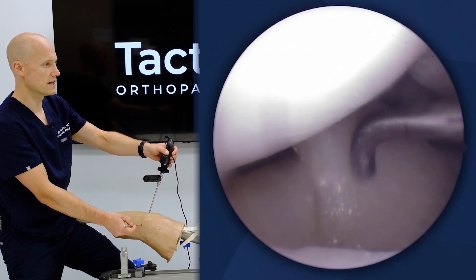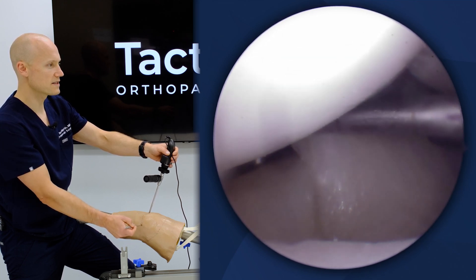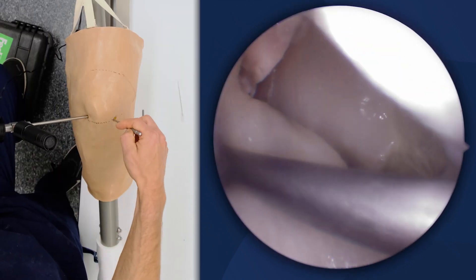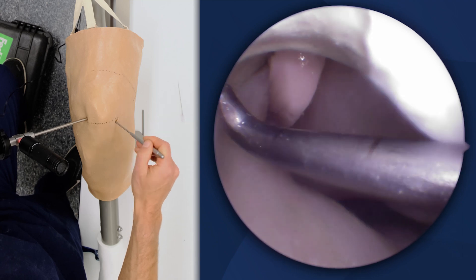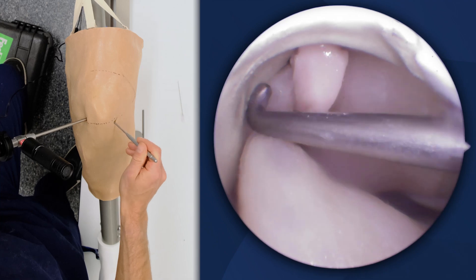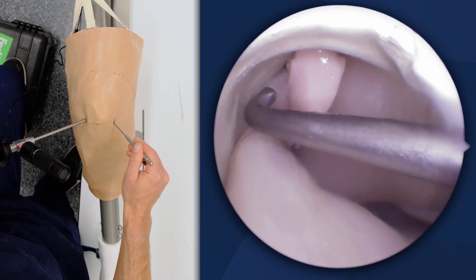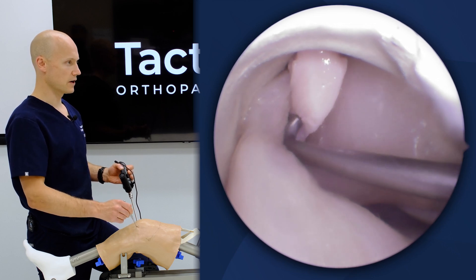Coming along, you can see how the ACL runs in continuity almost with the lateral border of the meniscus. I'm going to place my probe in here and come along and examine the lateral compartment. You can also see the fat pad in between the PCL and the ACL and how the septum comes through there. The femoral notch of the arthroscopic knee has been built with certain bony landmarks — these are going to be variable in everybody, but having consistent landmarks allows us to assess different surgeons' techniques on different occasions.